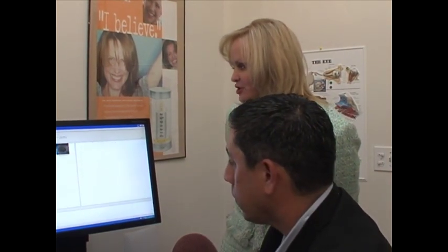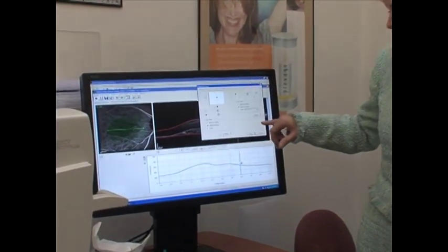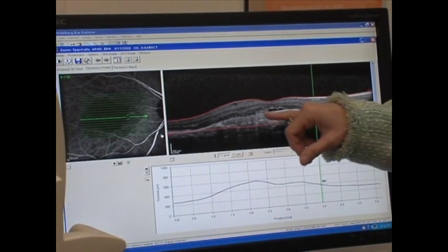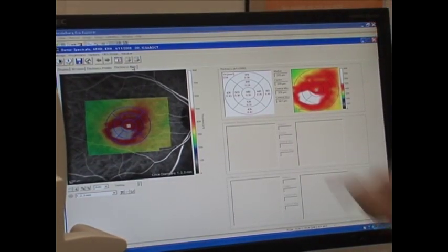We'll show you some macular degeneration, since it's such a common problem and such a frightening word for many people in Vero Beach to hear. In macular degeneration, this is Bruch's membrane, and you can see that rather than being a nice thin line, it's disturbed and it becomes thick and distorted. These are abnormal blood vessels and the retina is very thick in that area — 448 microns. In serial analysis, retina doctors are able to tell if their therapies with Lucentis or Avastin are helping the patient, not only by the improved vision, but by the thickness and improvement in the OCT on the HRT machine, giving an objective improvement in the patient with therapy.